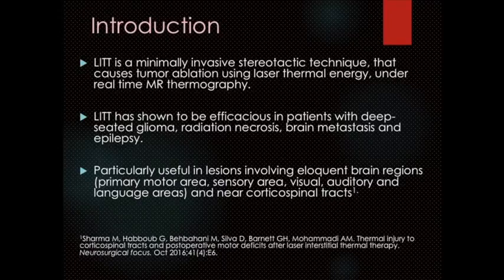We have previously shown, however, that overlap of the treatment lines with the corticospinal tracts can result in a significant new postoperative deficit. The following case will illustrate the technique that can be used to minimize potential injury to the descending corticospinal tracts or any other eloquent cortical or subcortical areas.